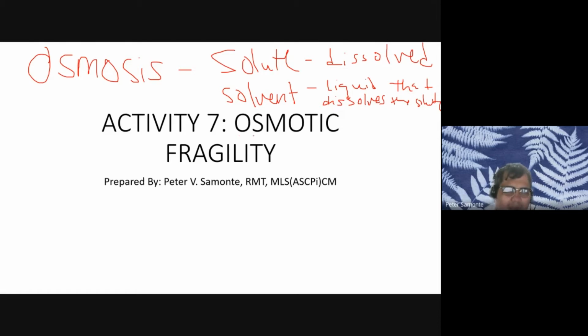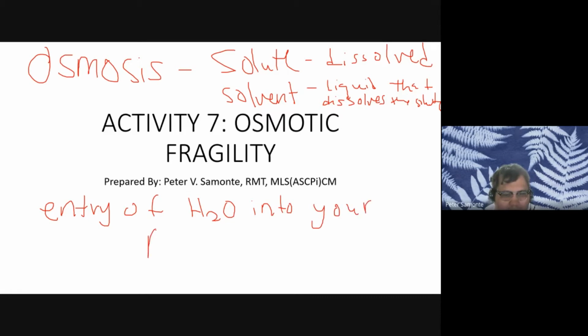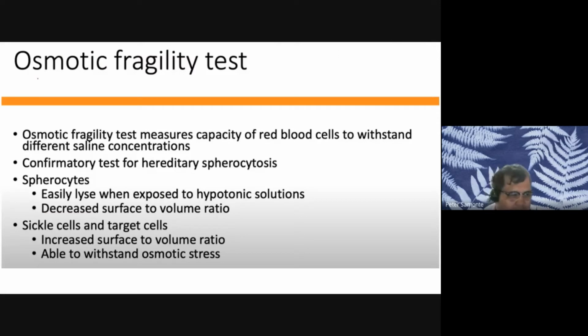Now, when we talk about osmotic fragility, class, we are talking about the entry of water into your RBCs.